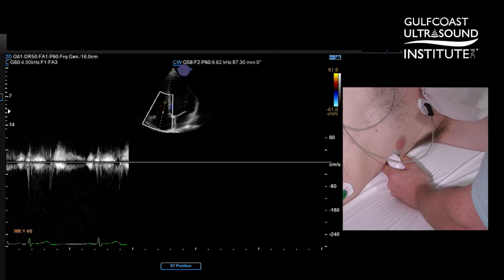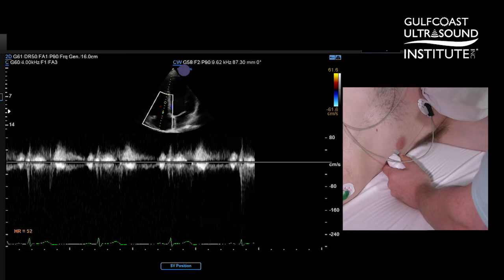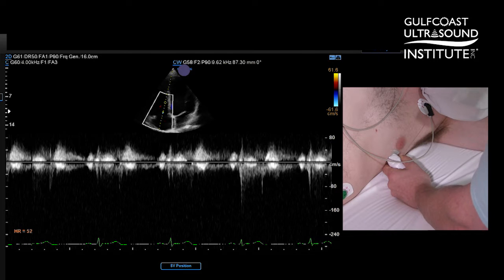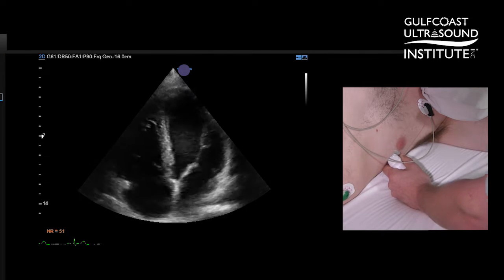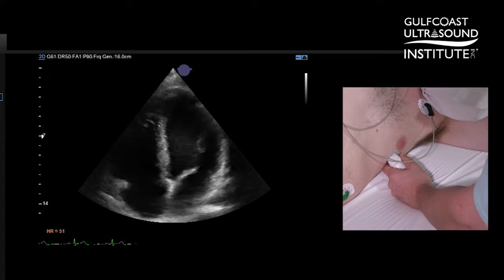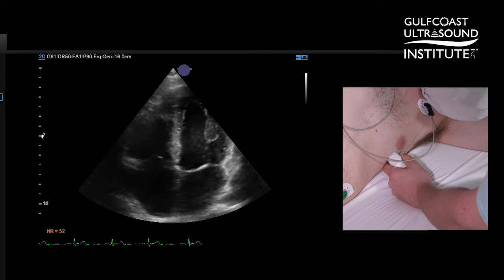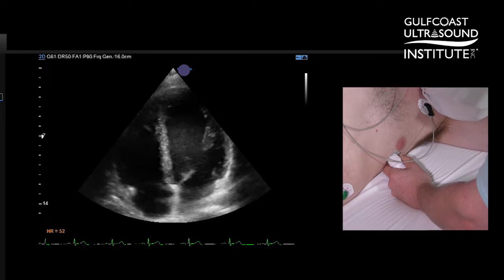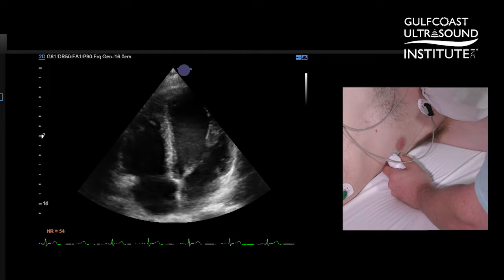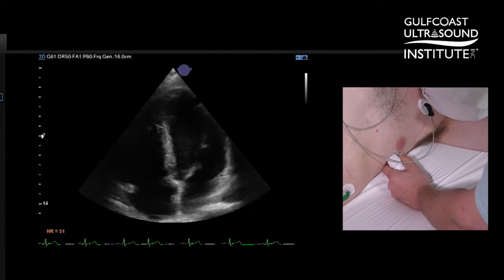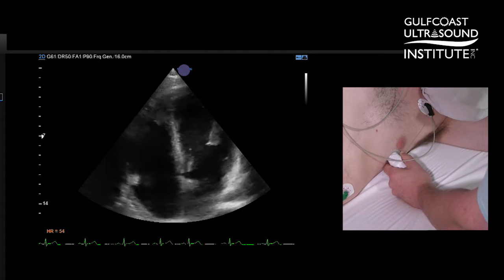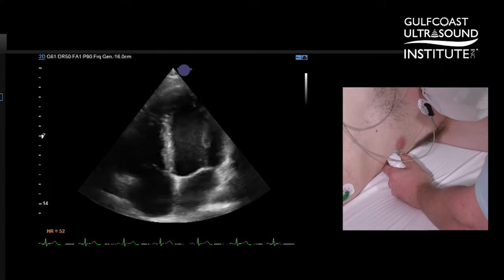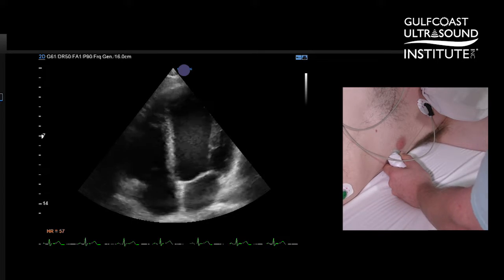You can see not much of a TR jet that we can really see. Of course we want to look at all of our views when looking at a TR jet, but sometimes going a little bit more off axis to a modified apical four-chamber view — which we use our landmarks here of the RV apex and the LV apex — can help.